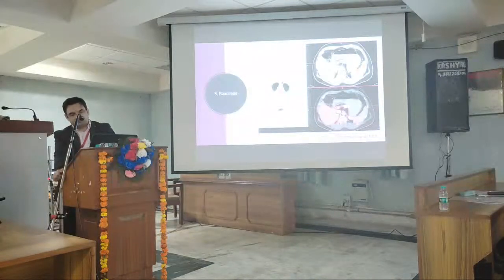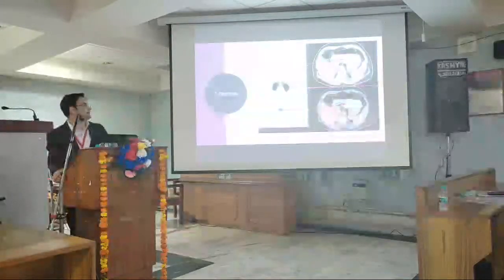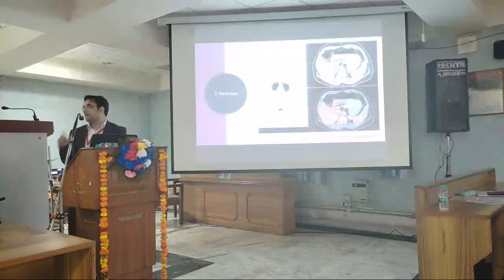Yes, definitely the radiologist can relook, but once we have the focal uptake and he sends a positive report, then we look retrospectively. That is quite appreciable to see, and we will find, yes, I have missed it.